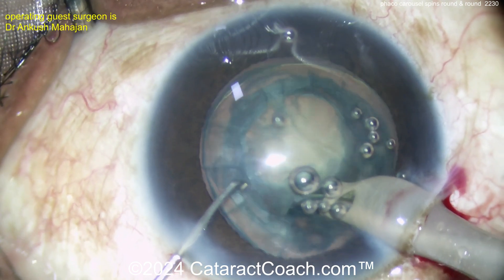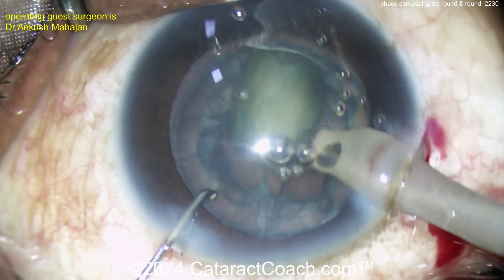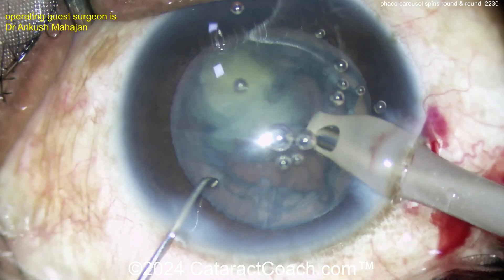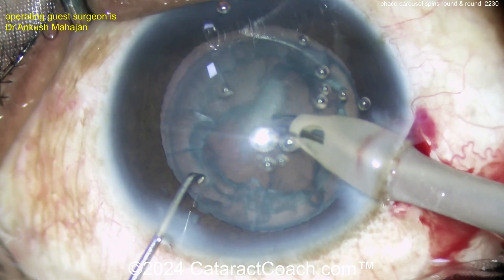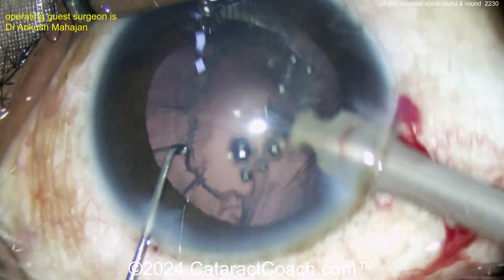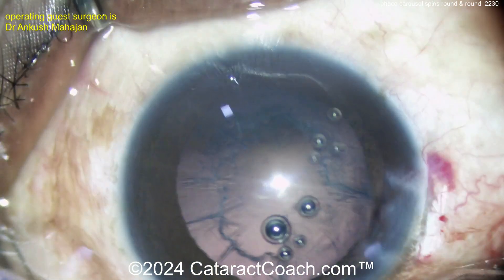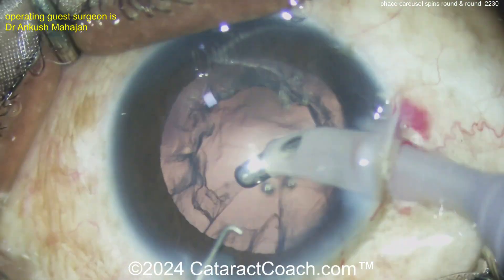Think about it — what settings would you use here? You don't need much phaco power, that's not the setting I'm worried about. What's the flow? You want to have a good flow so things move fast, let's say 40cc's a minute, maybe more. You want to have a good vacuum — sufficient vacuum to get that nucleus to follow. Obviously you're going to say that's too soft of a cataract; we do all kinds of cataracts and just want to present a new technique.